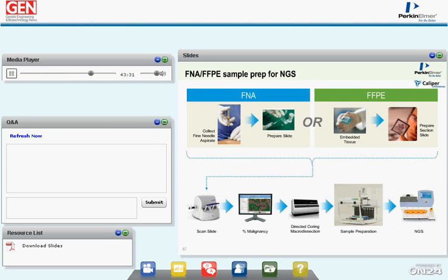This machine views the top of the FFPE block with a camera and aligns the H&E slide with the top of the block, and then directs the TMA coring drill bit to those areas that were identified by a pathologist as tumor and pulls tissue from the block directly and places that tissue into a PCR tube for subsequent DNA extraction, etc. Andrew will be talking about these steps in slides after mine.